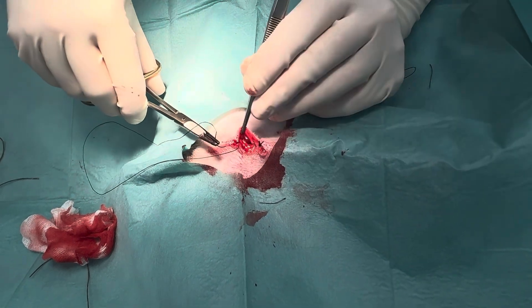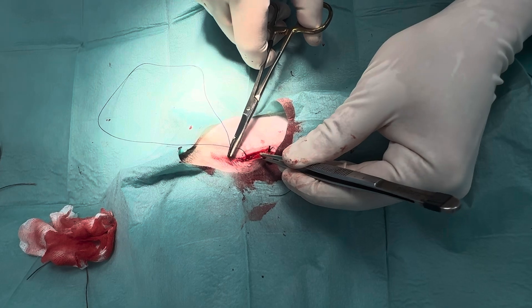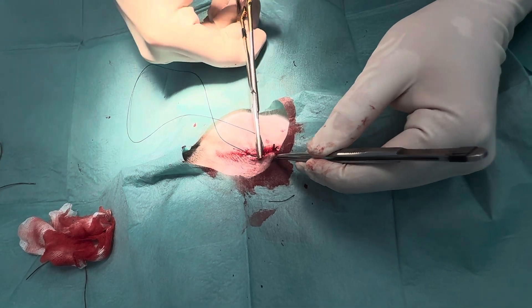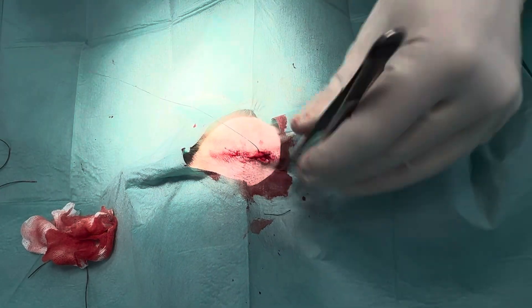I usually send home with a buster collar and give an injection of broad-spectrum antibiotics, which should already be done. And that's that — the surgery is very simple and straightforward. I do tend to find larger breed dogs bleed a little bit more in this region, probably because of larger blood vessels, especially when they have high blood pressure, which a lot of these breeds have. The surgical site looks good and there was no bleeding inside the incision.